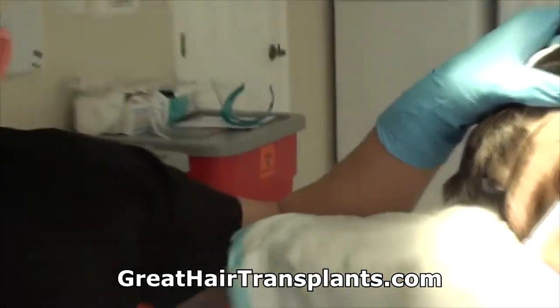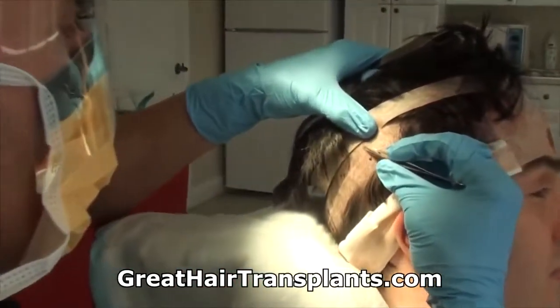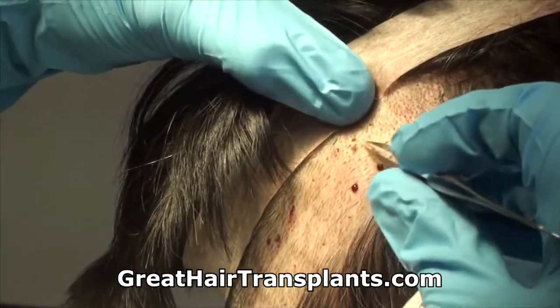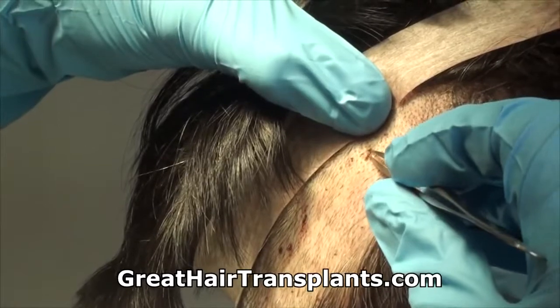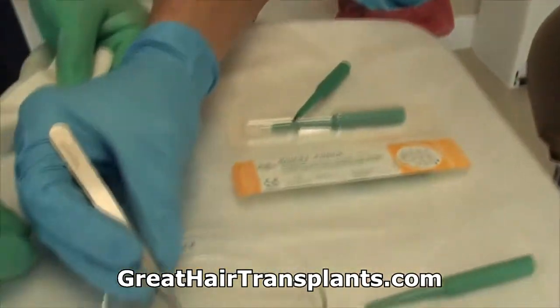So, thank you. So here it is in its environment. We're just trying to take that little guy out without destroying the follicle. Okay. So we pulled that out. Now let's take a look at this one.